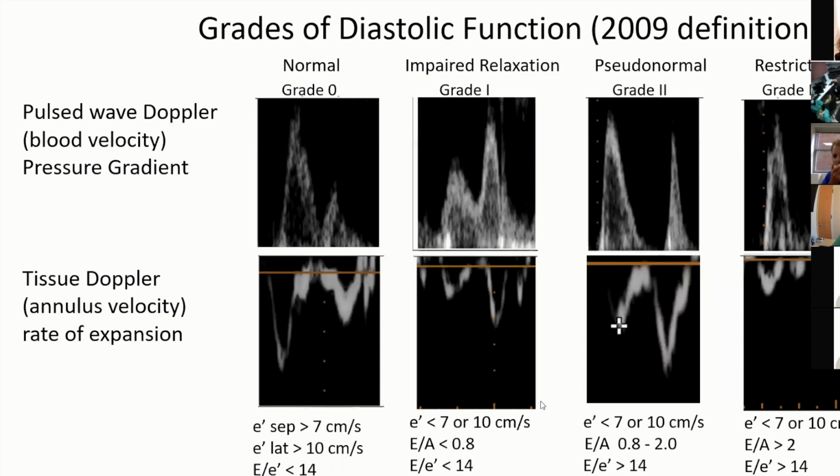And so when we look at diastolic dysfunction, I'm showing you this even though this is an outdated definition because the old definition relied on pattern recognition. But what you can see here is we would have an E, or an early wave of velocity of blood rushing into the ventricle. And as the heart gets stiffer, it slows down, but then it starts to speed back up. And why is that? It's because the left atrium pressure starts to get higher and higher because it's the only solution for elevated LV pressures or elevated LV stiffness.